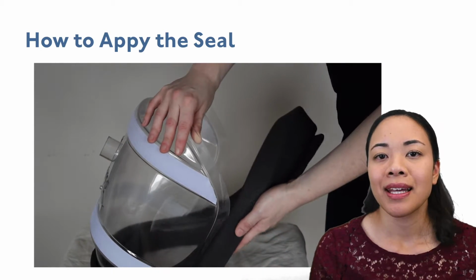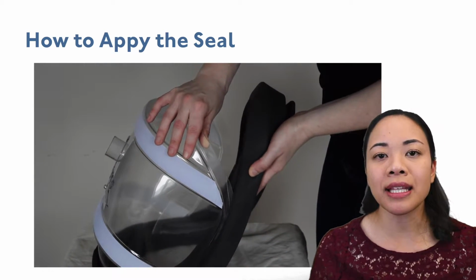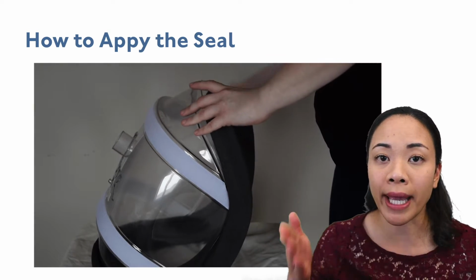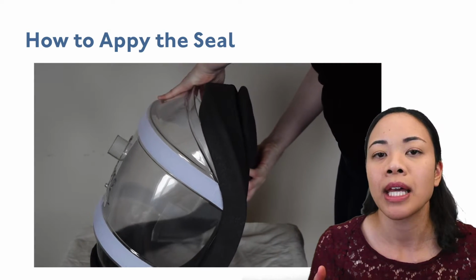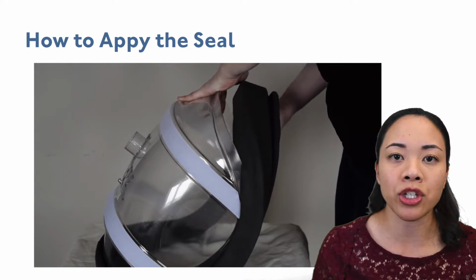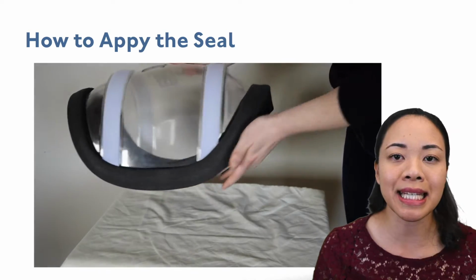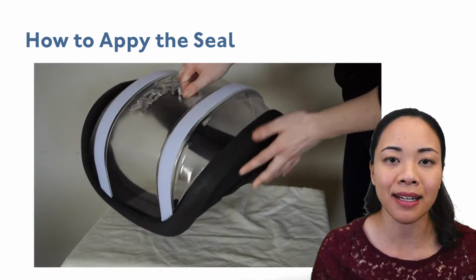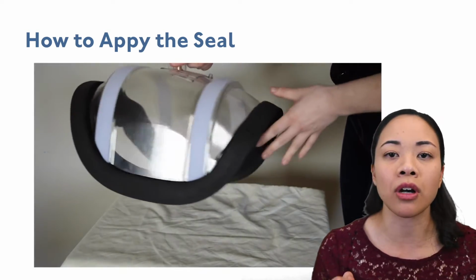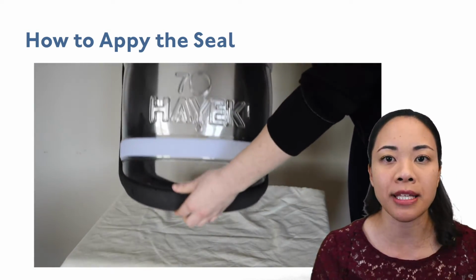Step 3. Starting from below, gently stretch and ease the seal's inner flap into position on the right and left side of the Cuirass. Gently fit the remainder of the seal to the corner and the bottom ridge edge of the Cuirass. Once the seal attaches around the sides of the plastic, adjust it so that the lip of the seal fully covers the ridge all the way around to ensure the best possible seal.